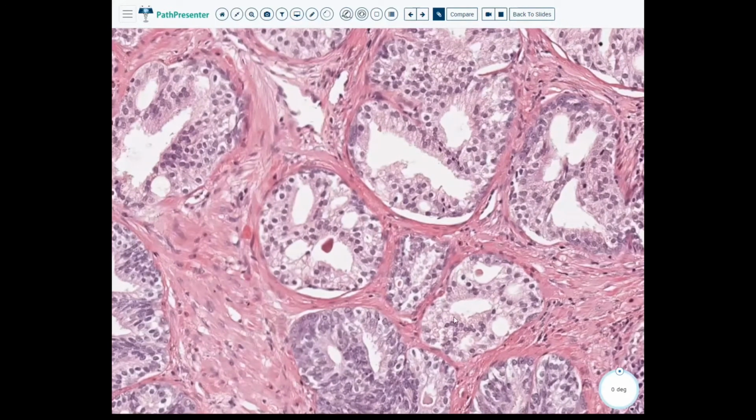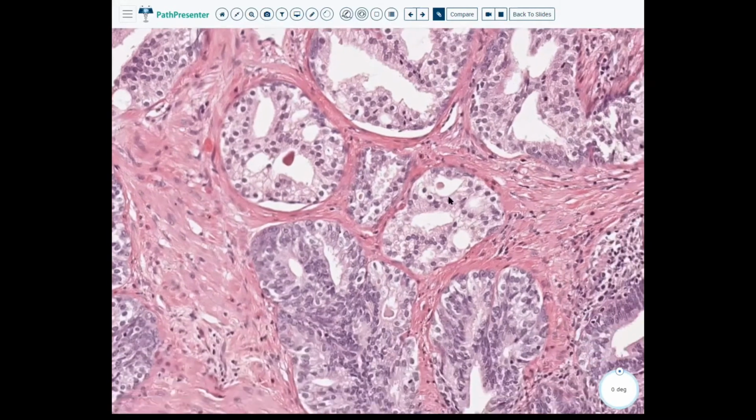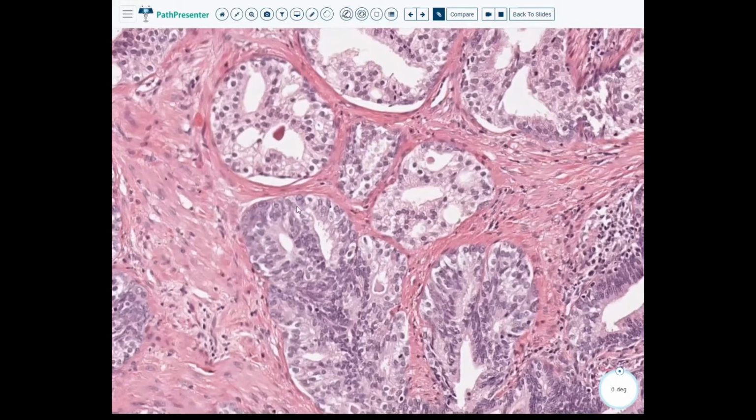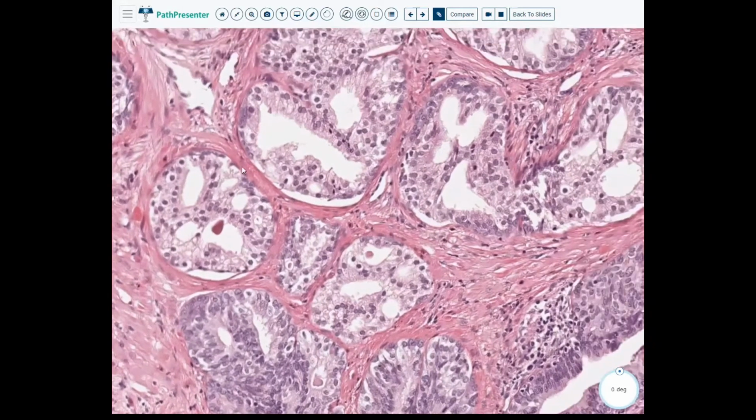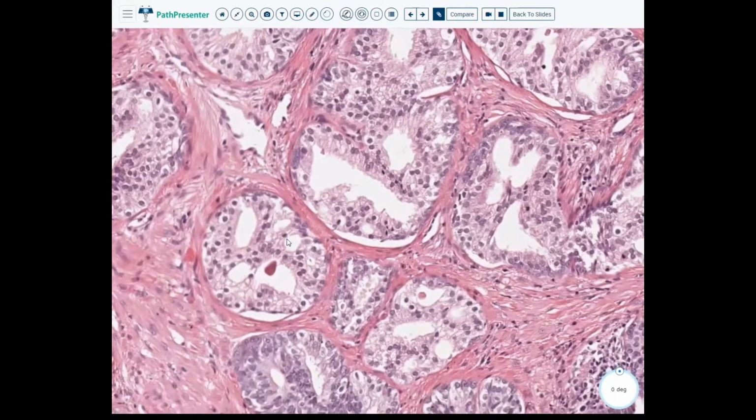So here we have this hyperplastic lesion. It does still have that cribriform architecture, but you can see it side by side with the basal cells. These are not basal cells. They look a little more like luminal cells, right? And we can't really tell, like maybe these are basal cells here that have just been pulled up with some retraction artifact, but kind of hard to say. Some of the cytoplasm also is a little more clear. So this kind of stuff here falls more into what we would call clear cell cribriform hyperplasia. So there's a couple different things going on.